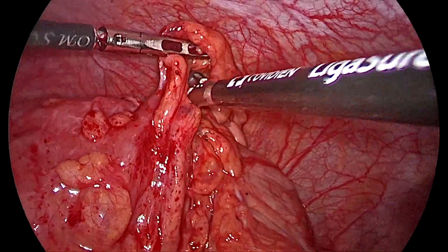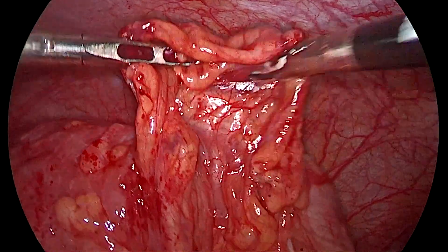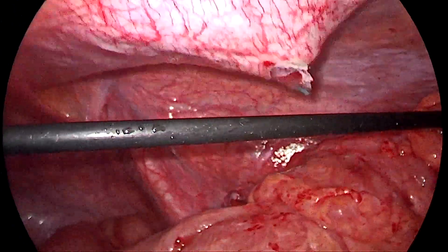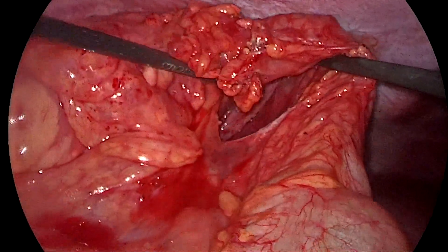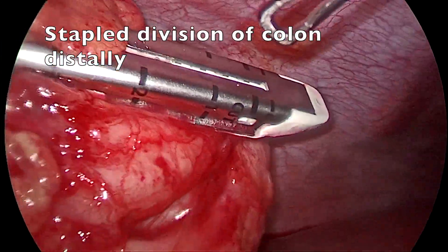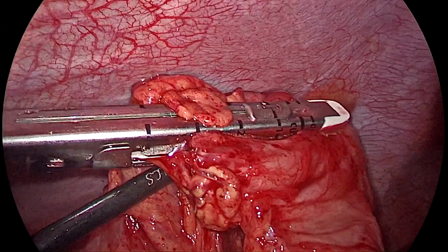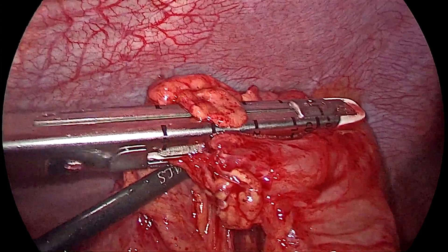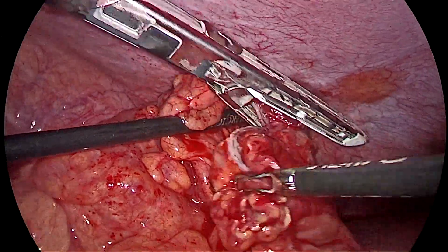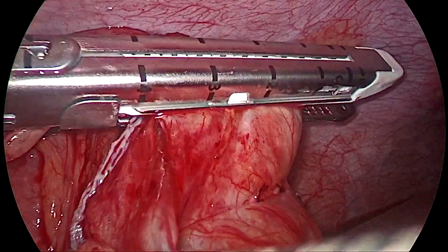Once we have cleared the colon, we will put a 12 mm port through the right iliac fossa from where we will also perform the ileostomy. We then place an endo stapler and fire using a white cartridge because it gives less bleeding. We fired the first cartridge but it was not complete, so we fired another cartridge.